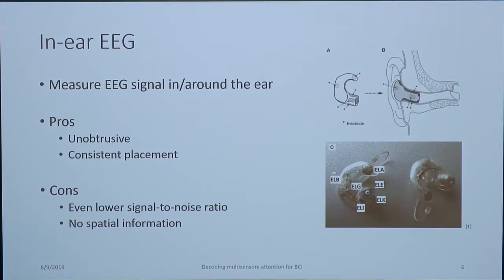For example, it is unobtrusive, just like an earplug. And also, every time you put it in, it's at the same spot. Compared to the surface EEG, depending on how you place the cap, the electrode position may actually change from time to time. But for this one, it's very consistent across sessions.